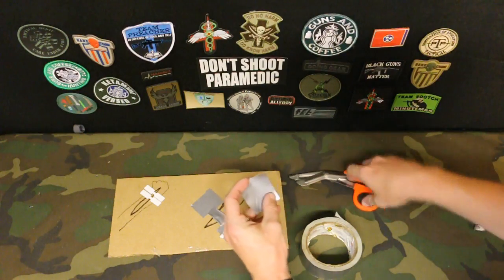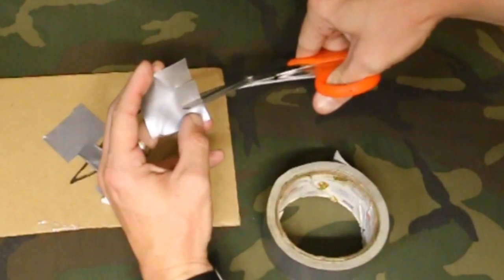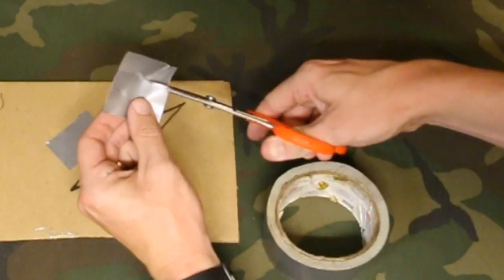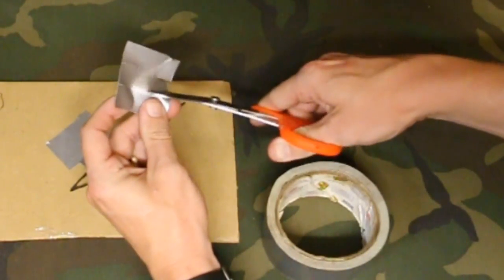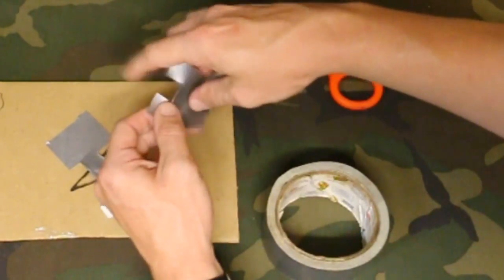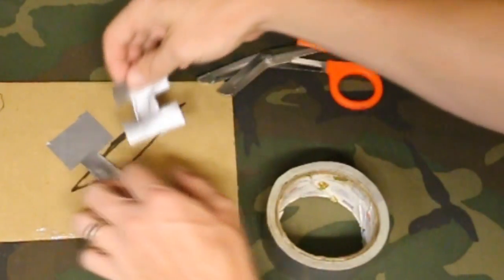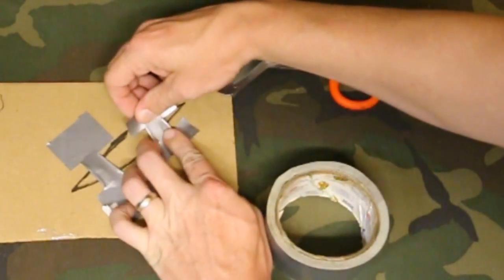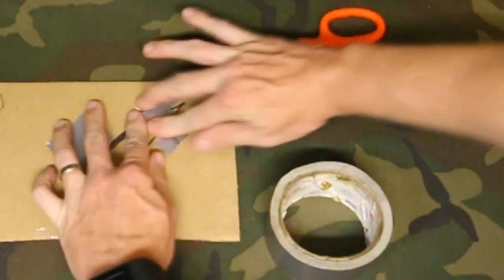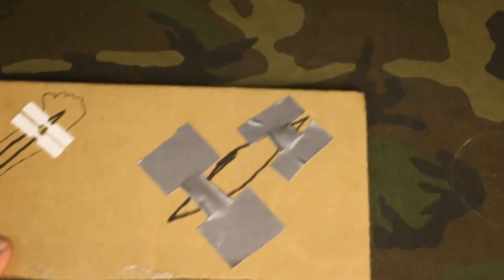Cut it. Make and cut across there. Cut across there. Cut across there. So we fold here in the middle. Fold on this side. And there we go. We've got another one. Let's put it right there. So you can make them all different sizes, whatever to fit your need.